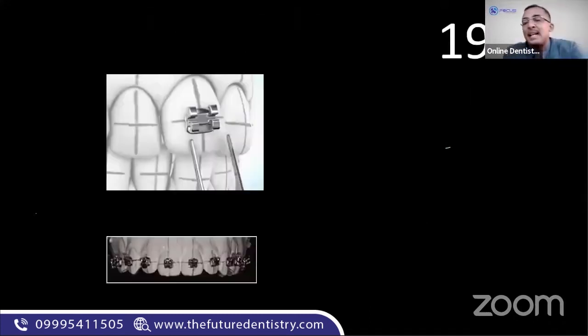Question number 19 here. That can be a tricky question. It was there in the Canadian board, if I remember correctly, last year. One picture like that and asking a question. Explain a scenario where you fix a bracket onto the cast. If you look carefully, the brackets are fixed to the cast. Can you see that? Why do you fix a bracket to the cast when the patient is sitting there? Can somebody here come to the answer on that? Why is a bracket fixed onto the cast?